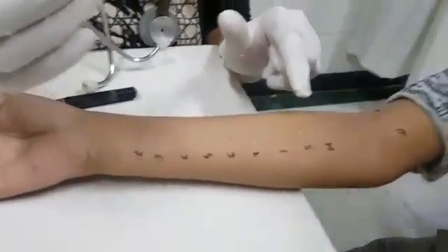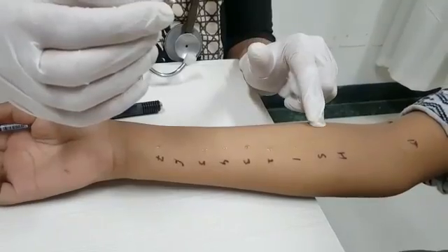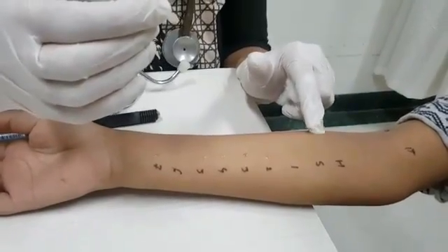This way we have put a drop and just lifted the skin with the needle, and we will leave it. Now we will dab it and after 15 minutes we will see the reactions.